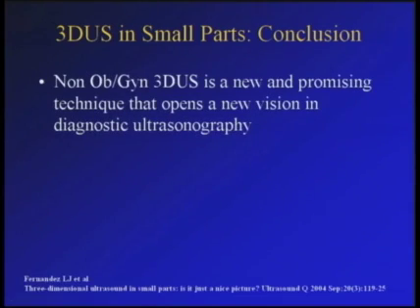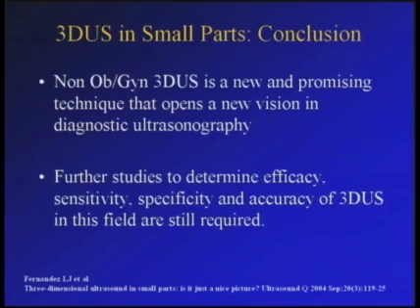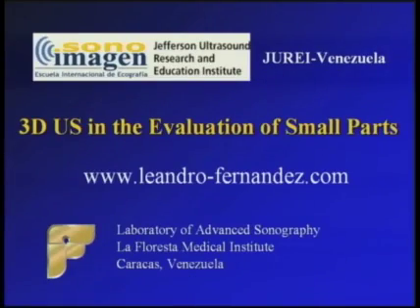Non-OBGYN 3D ultrasound is a new and promising technique that opens a new vision in diagnostic ultrasonography, but absolutely further studies to determine efficacy, sensitivity, specificity, and accuracy of three-dimensional ultrasound in this field are still required. 3D ultrasound in the evaluation of small parts.